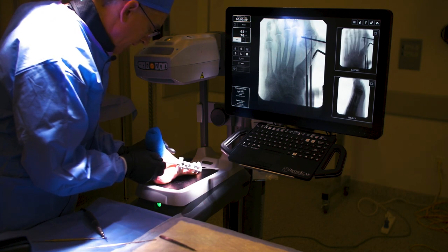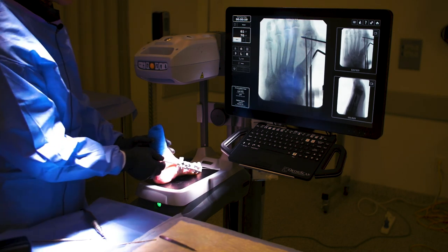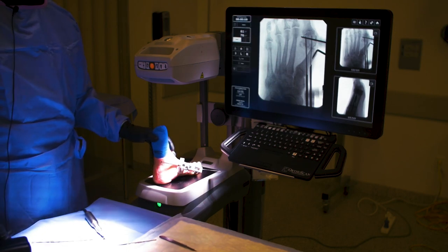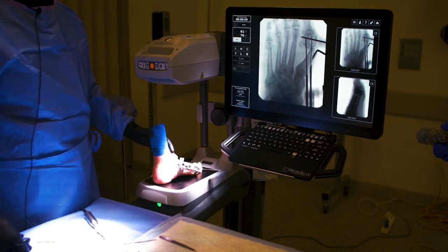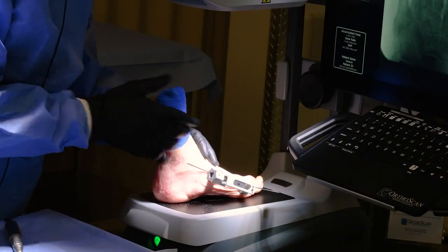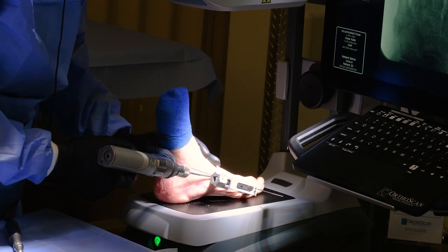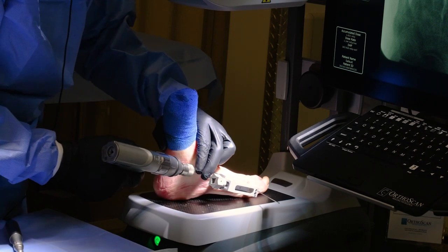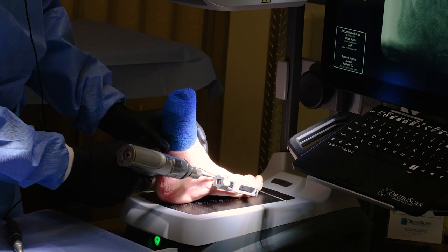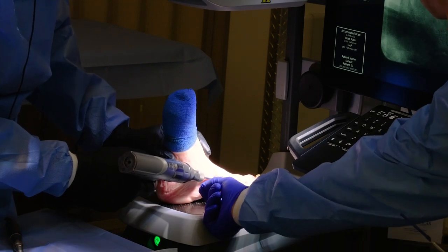We're measuring 54. I want this to sink into bone so we're going to go to about 50. We measured our depth; now we're going to drill. Drilling is important because this is a fully threaded screw — if you go through the far lateral cortex without drilling first you can actually distract the head. I can leave the guide on so I don't mess with the head, which is perfectly fine. Moving the other wire out of the way, getting ready to go through that cortex — a lot of this is feel. Right through; I drill into the head a little bit just to enter, and I'm done.